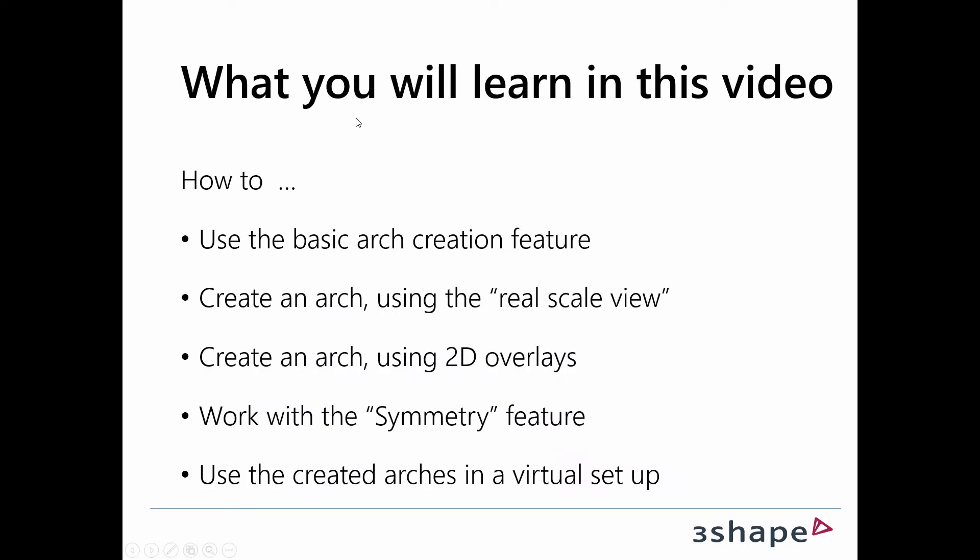In this video, you'll learn how to use the basic arch creation feature, how to create an arch using the real scale view, how to create an arch using 2D overlays, how to work with the symmetry feature, and how to use the created arches in a virtual setup.